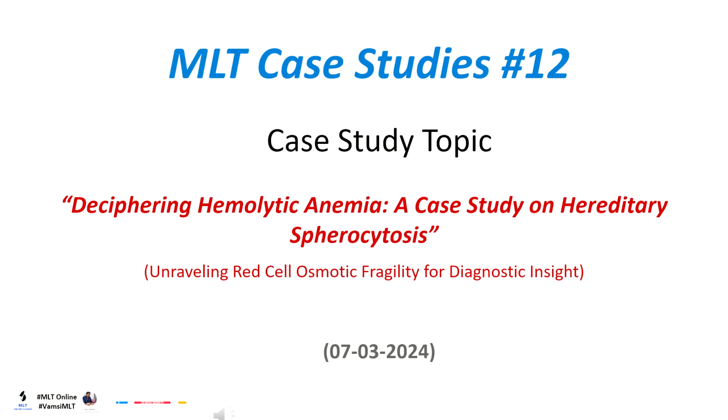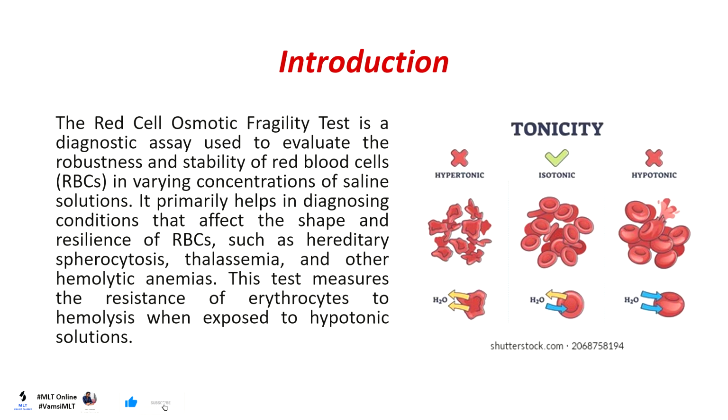MLT Case Studies Series 12. A case on the topic: Deciphering Hemolytic Anemia, a case study on hereditary spherocytosis. Unraveling red cell osmotic fragility for diagnostic insight.